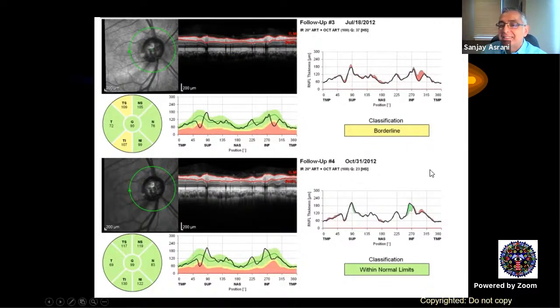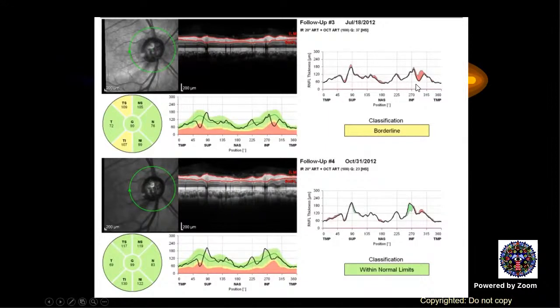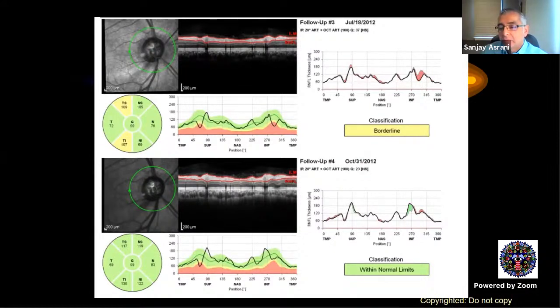Any other possibilities? So it can't be retinal nerve fiber layer edema from inflammation because it is very focal. You don't get focal edemas in inflammation. How can this patient regrow nerve fiber layer? Anybody? Doesn't have to be a resident. Rolika? Any ideas?